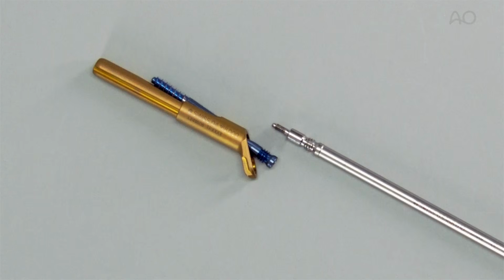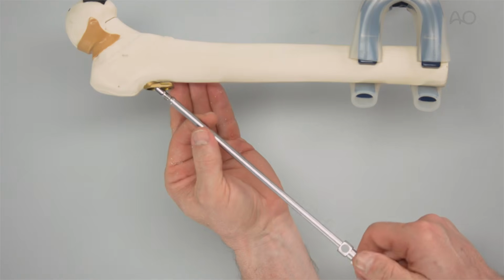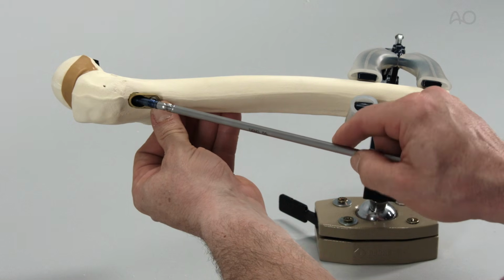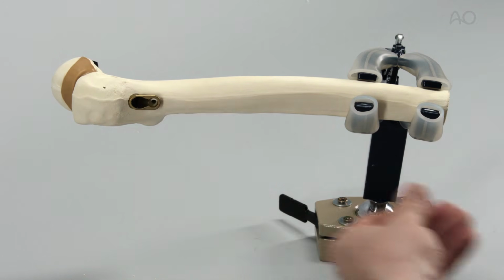The multifunction rod for insertion handle can also be used to remove the anti-rotation screw and the plate bolt construct. Observe that the head of the multifunction rod features 2 different thread diameters. The head of the multifunction rod is inserted into the anti-rotation screw with manual clockwise turns. The multifunction rod is firmly pulled and, if necessary, turned counterclockwise to fully remove the screw.